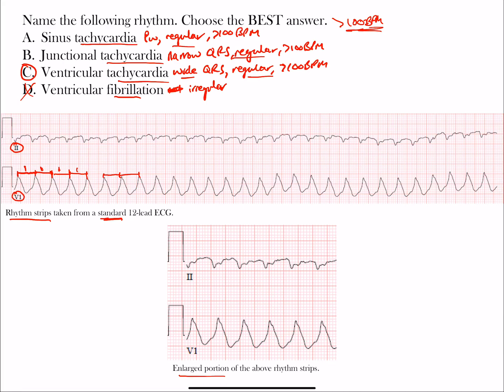It's not junctional tachycardia because it's not a narrow complex, although it's regular and fast. How do we know it's fast? Remember we can find the rate by finding one of those QRS complexes that falls on or near one of those thick lines. If you take this one here and find the next one, it's almost about two. The rate is certainly, if you do 300 over 2, that gives you 150, but it's a little less than 2, so it's probably greater than 150.